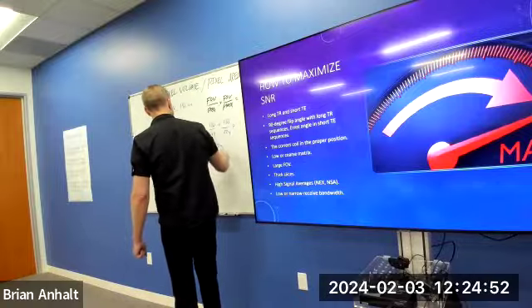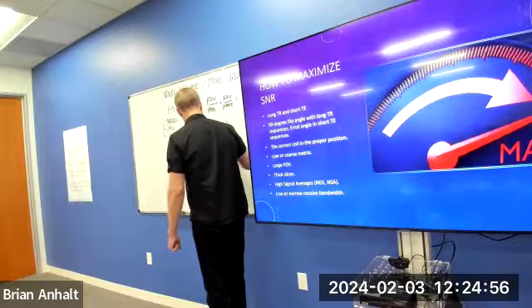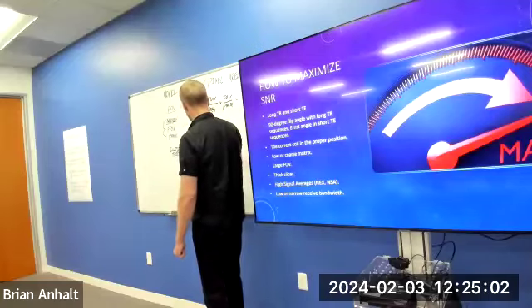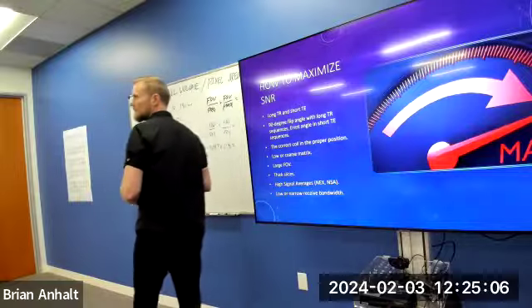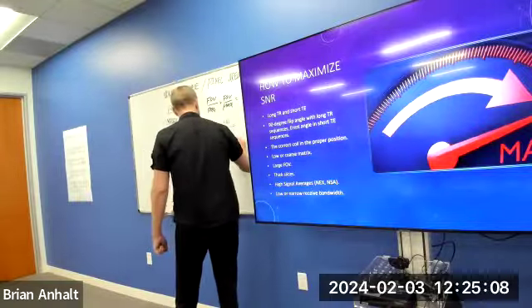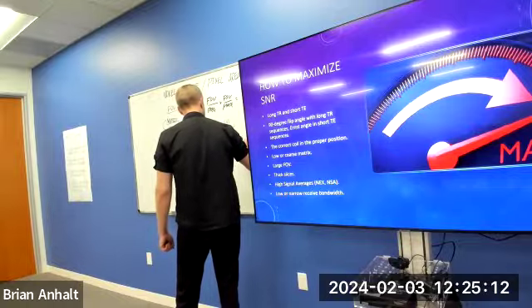And what's 180 divided by 224? 0.80? Yeah. 0.8. Then you just multiply 0.8 times 0.47 to get 0.38 millimeters squared.